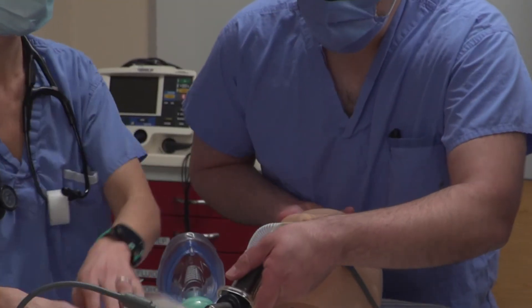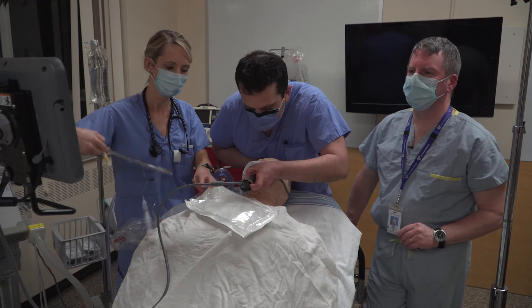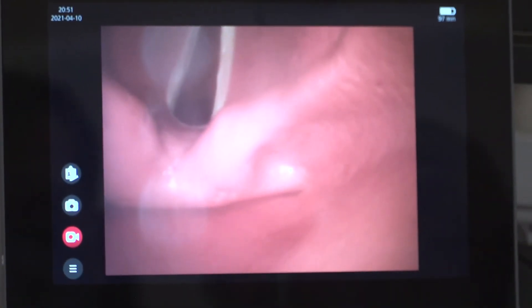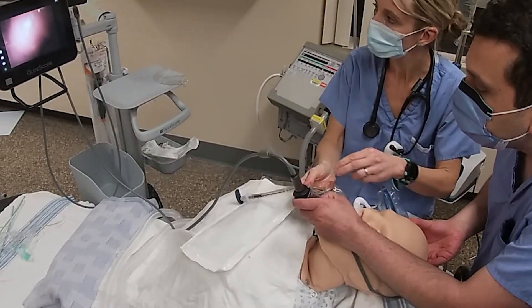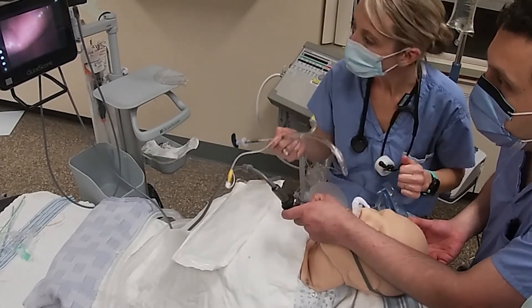Once the glottic view is obtained, with one person using both hands to get the best view of the glottic opening, the second person can use both their hands to manipulate the endotracheal tube with the rigid stylet to align the tube tip for insertion. Upon placing the tube, the proper depth can be confirmed using the black lines on the tube — one in and one out.